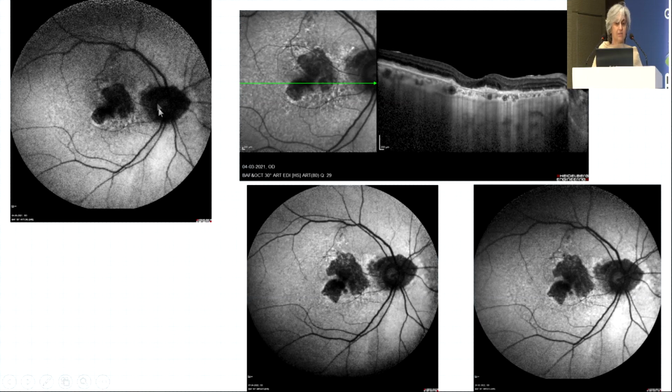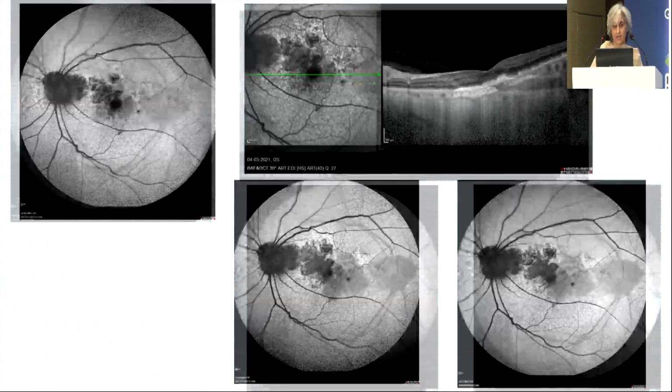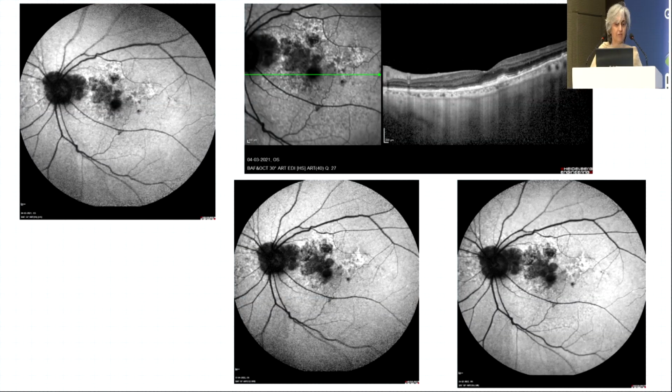You see, this is when the patient started out, and this is the B scan OCT showing this intermittent, interrupted pattern of disruption of the outer layer, choroidal hypertransmission. You see a couple of years later, there is a definite increase in loss of autofluorescence. But you look at it 2 months later, it's not changed. This indicates that geographic atrophy is slow to worsen. It doesn't happen overnight. And this is again the fellow eye of the patient.